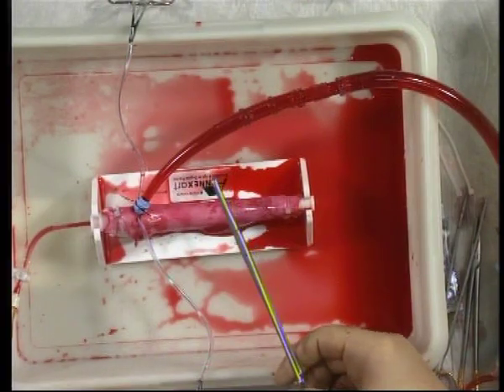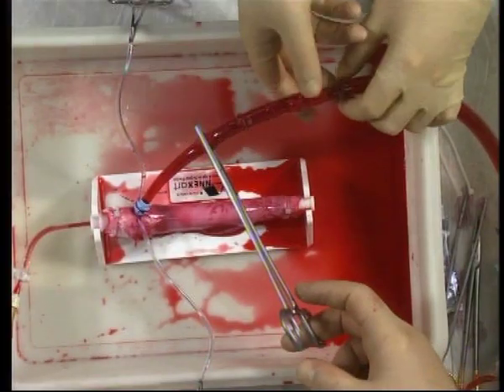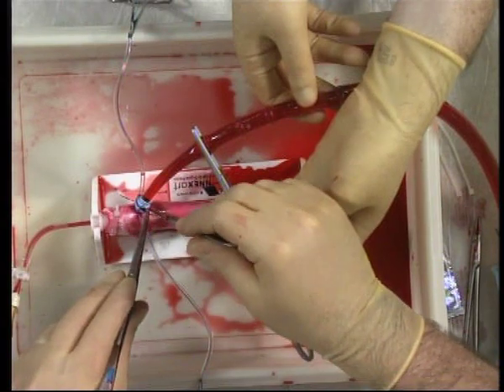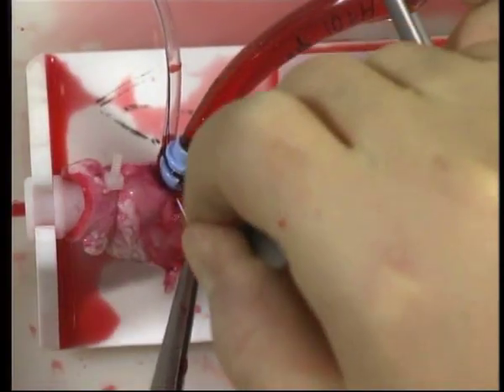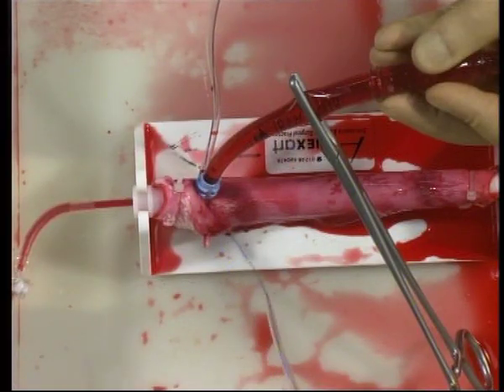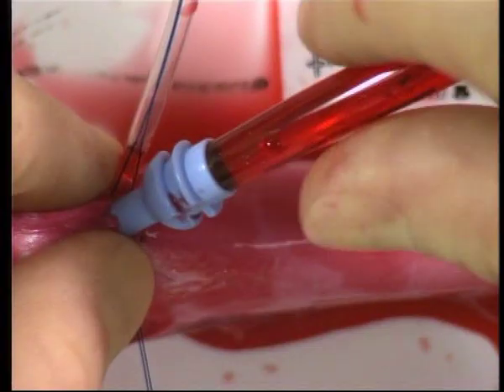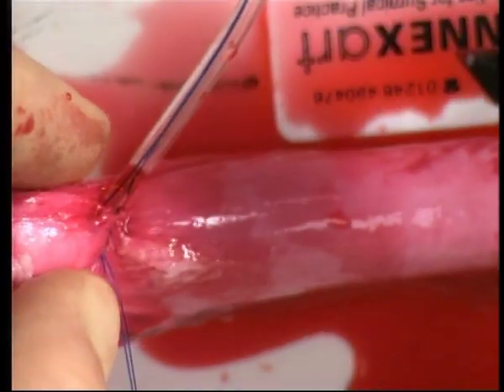When you are ready to decannulate, clamp the aortic cannula and ask your assistant to support the cannula and the clamp. Cut the retaining suture and loosen the snuggers. At all times, support the aortic cannula to prevent it being dislodged accidentally. Controlling the aortotomy, carefully withdraw the cannula and ask your assistant to snug down.